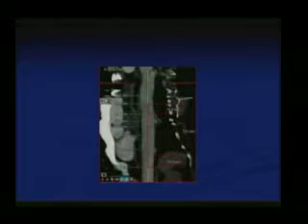The concern is, shall we just cover this? This can be done with a 10 centimeter stent graft. If we exclude both, then we need a 15 centimeter stent graft. Then we end up asking, are we covering too much aorta? Are we causing any risk to the blood supply of the spinal cord? But given her subclavian was open, we're not touching the vertebral artery.